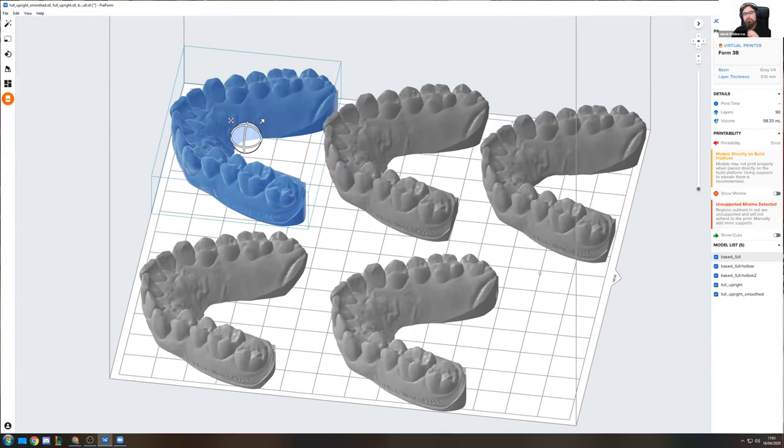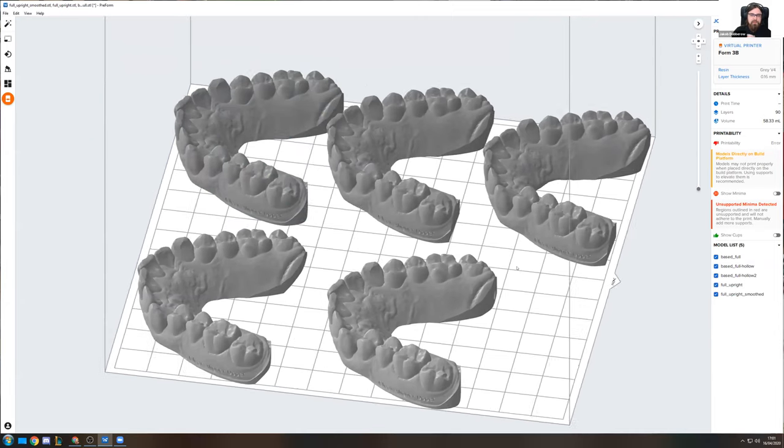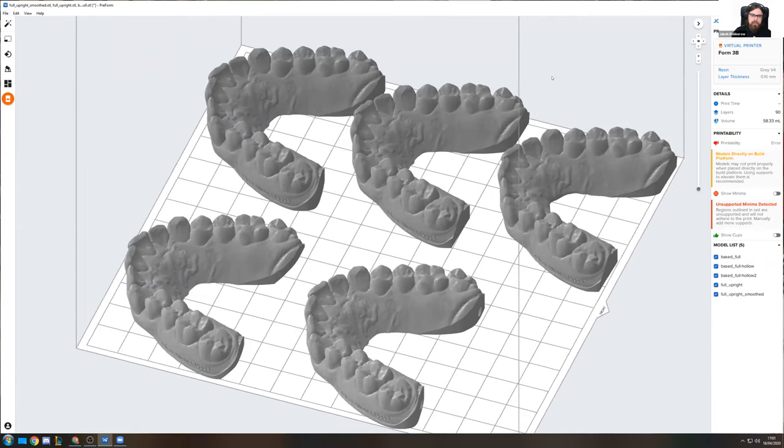I have already input a couple models here. It's basically the same model in different variations that I want to show you, but you would just typically be going into the file settings and then just hit open as you would with a lot of other softwares. So in here, like I said, I have the same model just multiple times as I want to show you a couple differences here. But typically, you would have just one model of every single step, for example, in your dental model.